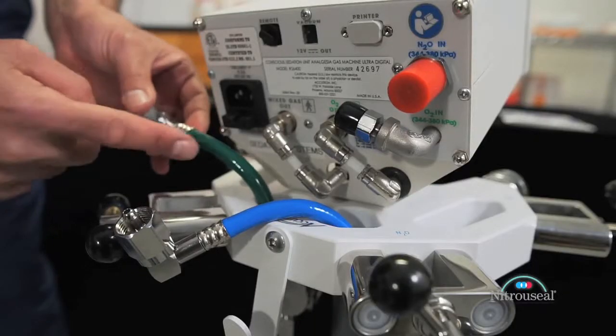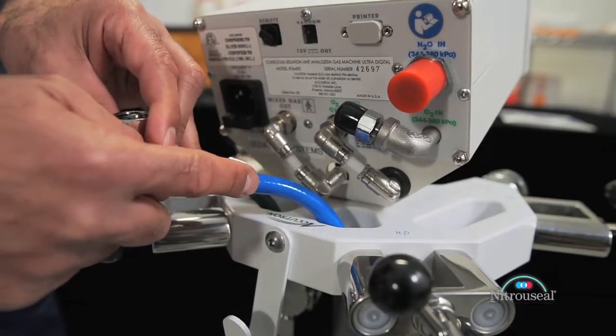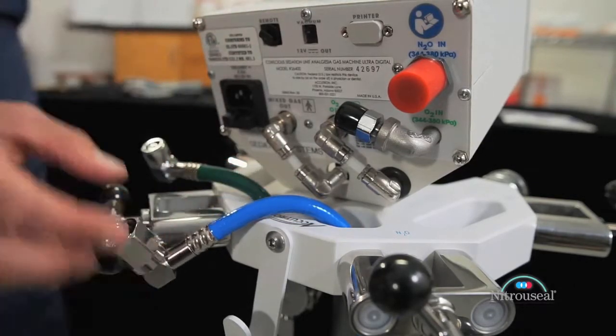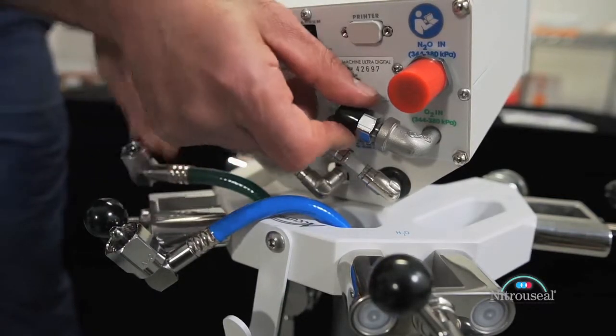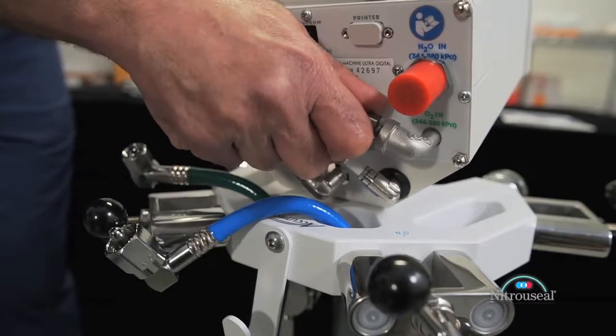Next, attach the gas supply hoses to their respective input sockets on the back of the flow meter. There are two hoses, a green one for oxygen and a blue one for nitrous oxide. Each hose has an end coupling that fits only its corresponding input socket on the flow meter to assure the correct coupling arrangement.